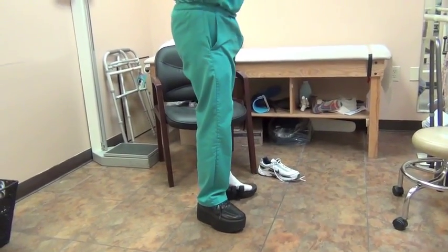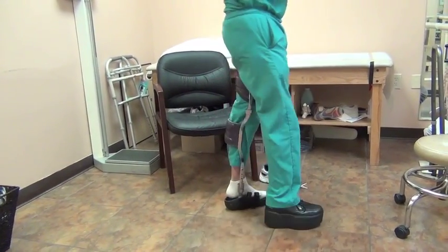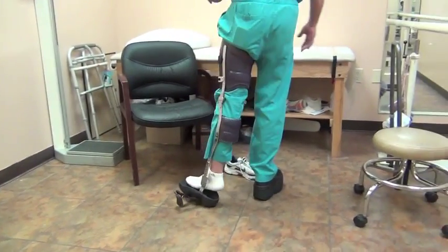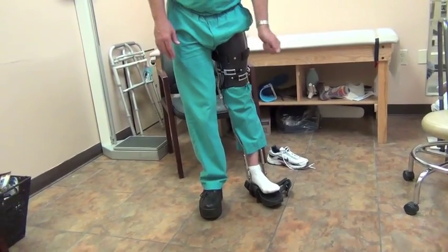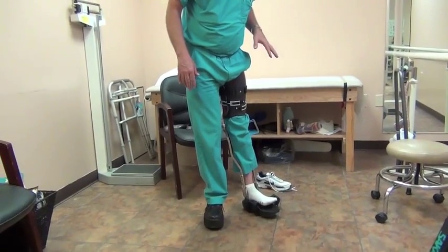There is a little bit of pistoning inside the brace, but it's still very tolerable and comfortable. I'm going to leave the thing like that to show you that even in gait, this is very efficient.